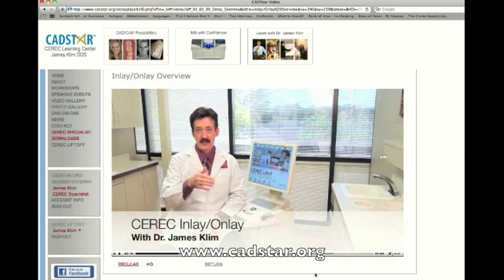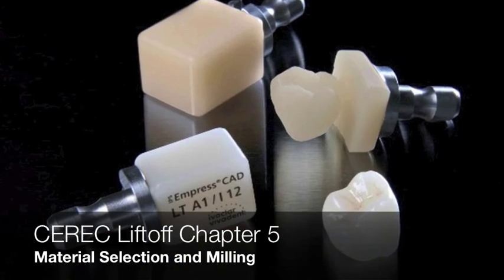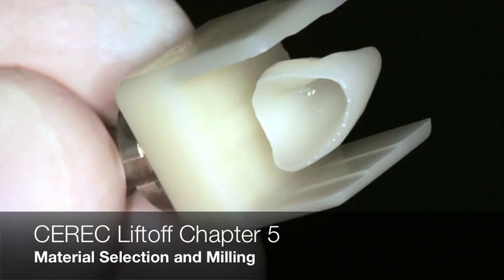Chapter four will always keep growing as applications develop. We also have additional design content in chapter nine, which I'll get to in a moment. After chapter four — our virtual design chapter — we have what we call the block selection chapter: how do you choose your materials, how do you mill, and how do you optimize that result? That's chapter five.